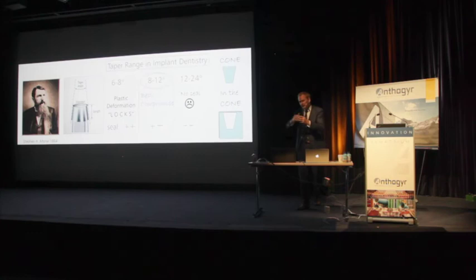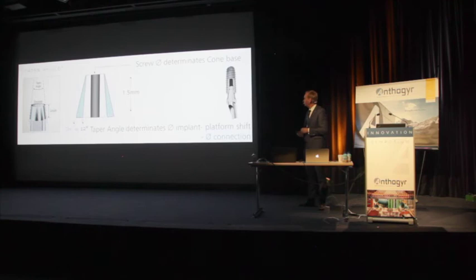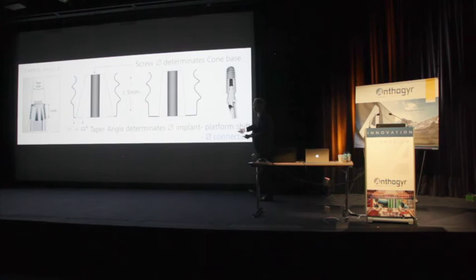We can still take the parts apart, so the abutment of the implant, without problems. And it's the best practical compromise with a relatively good seal. And then let's see how a 24 degree taper performs versus a 12 degree taper. And so these two groups. If we draw an implant around it, and this is a 12 degree conical connection versus a 24.